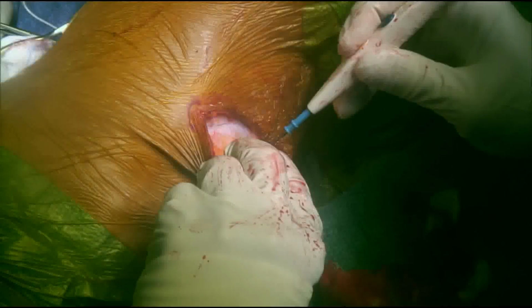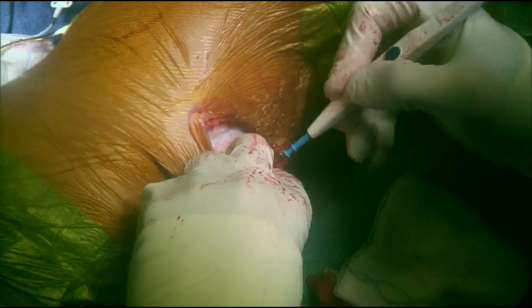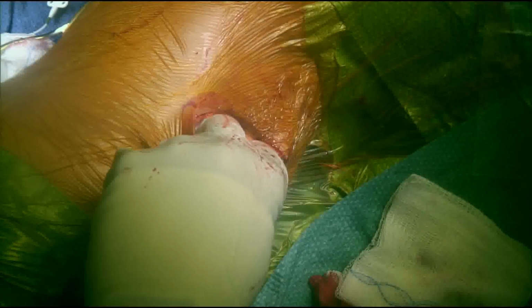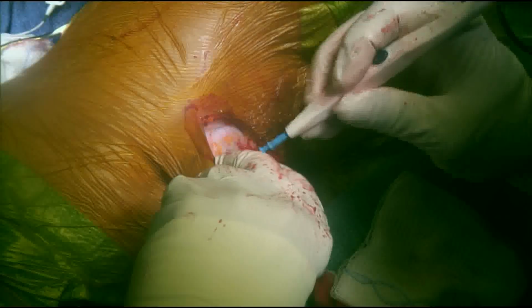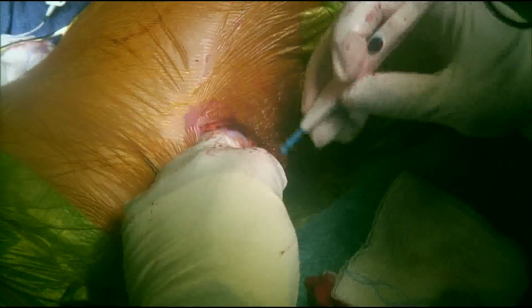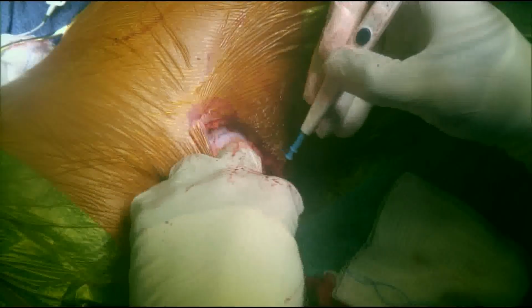In the top left part of the screen, you can notice the fixation anchor, which is used to fix the spinal catheter to the deep fascia. This is usually passed over the catheter and directly into the wound all the way down to the deep fascia, and you can see that there are 2 holes in this anchor, and you would use non-absorbable sutures to fix the anchor to the deep fascia.